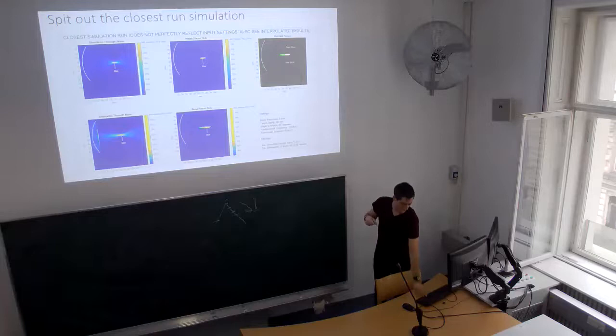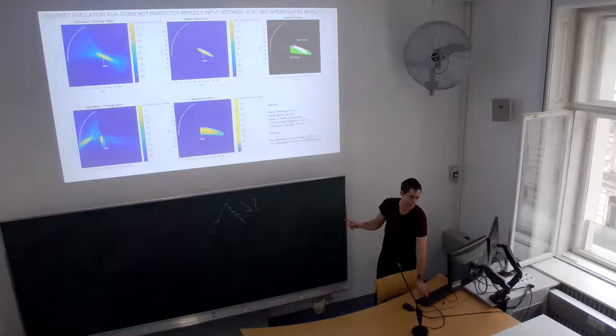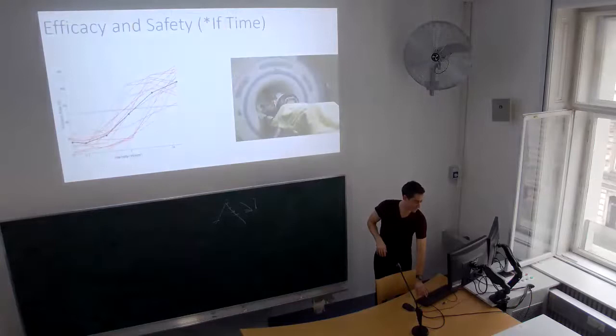It's really useful in the planning phase, right? Because maybe I don't know what to do. Maybe I'm thinking about hitting something, but it's at a crazy angle. I can play with 10 degrees, 0 degrees, 20 degrees, that sort of thing, and see what it does. And it can really matter, right? Here's some parameters that make sense and here's some that don't. You look at this, we're getting tons of attenuation. It's refracting 2 centimeters. The beam is huge, or the focal point's huge. You wouldn't want to do this, right? You might use my function, it's called SmartFuss, and decide, oh, I don't want to do that. Okay, so starting off, I think that's a good way to get into the whole simulation business.